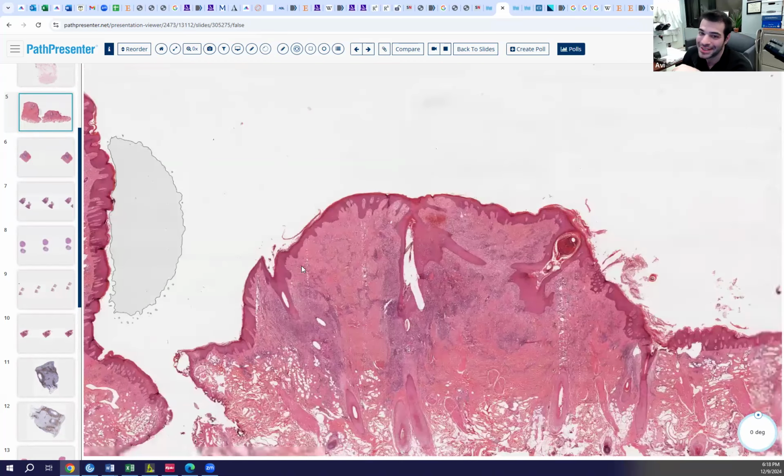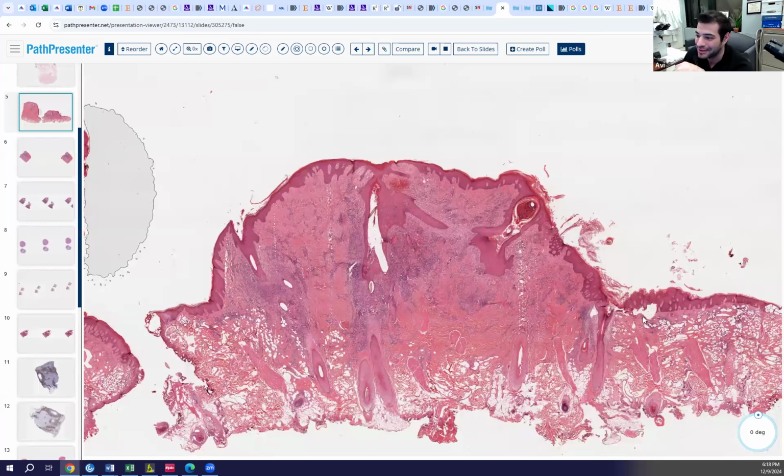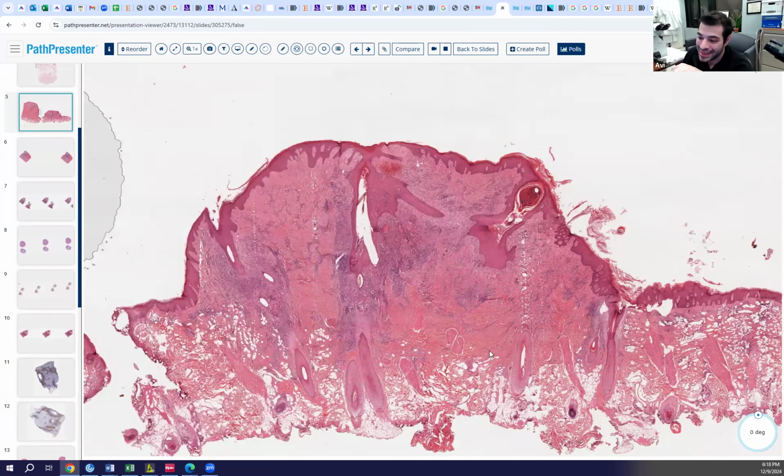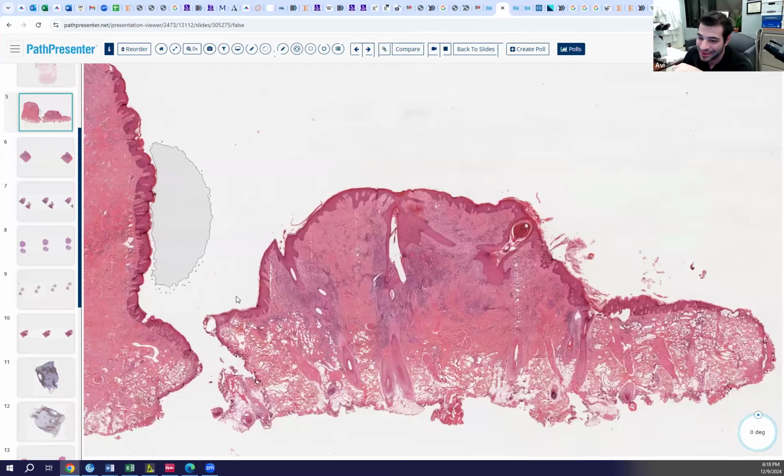And by the way, you see the architecture of it, right? What's the architecture? Like keloids. It's not a true keloid, but what's the architecture? What do you see when you see AKN clinically? Describe it.